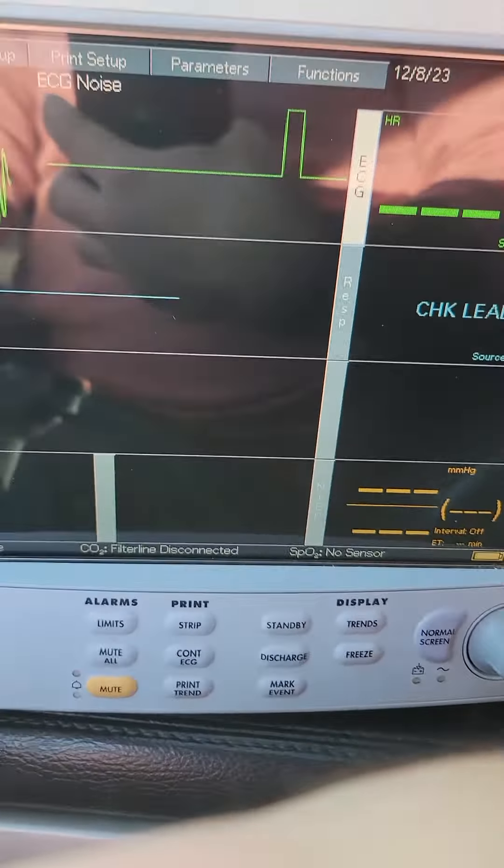Okay, and now, as soon as I put my finger on the tips, oh, look at that. There's a waveform.